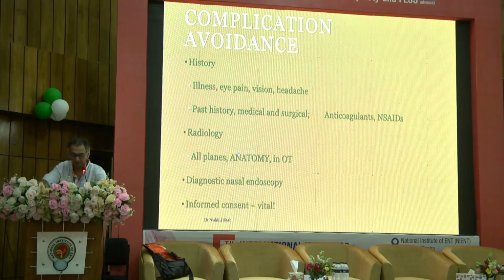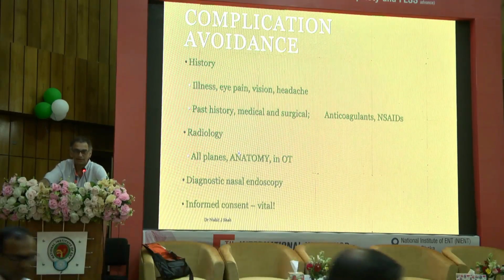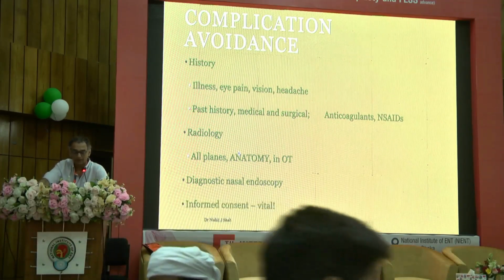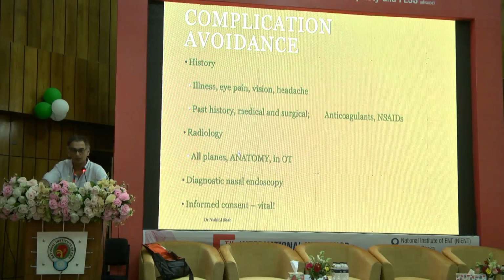Of course, it's a good idea to do a diagnostic endoscopy because that gives you additional information which a CT scan cannot. A CT scan is shadows, it's interpretation of what you feel. But an endoscopy is actually seeing whether its soft tissue is more like a tumor, more like a polyp, is it adhesion, synechiae, is it just in contact, etc.